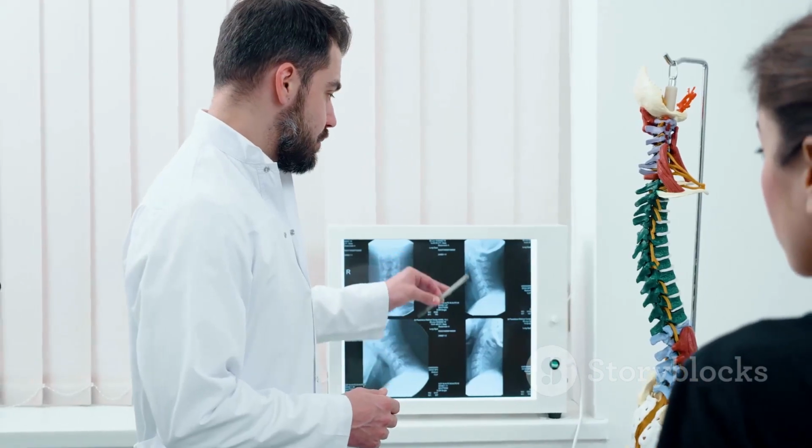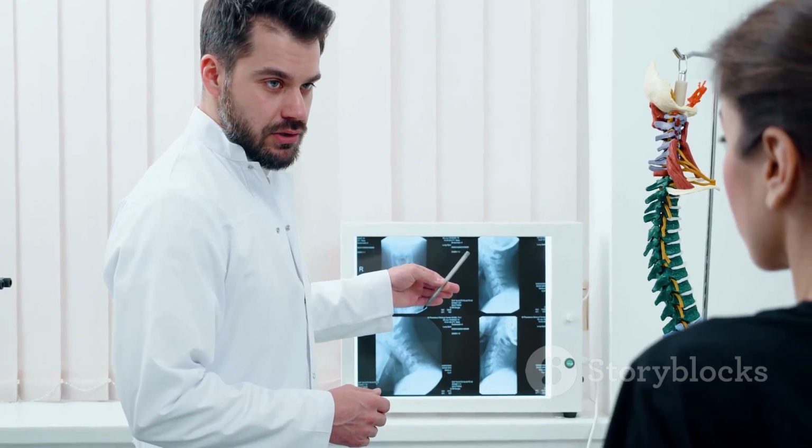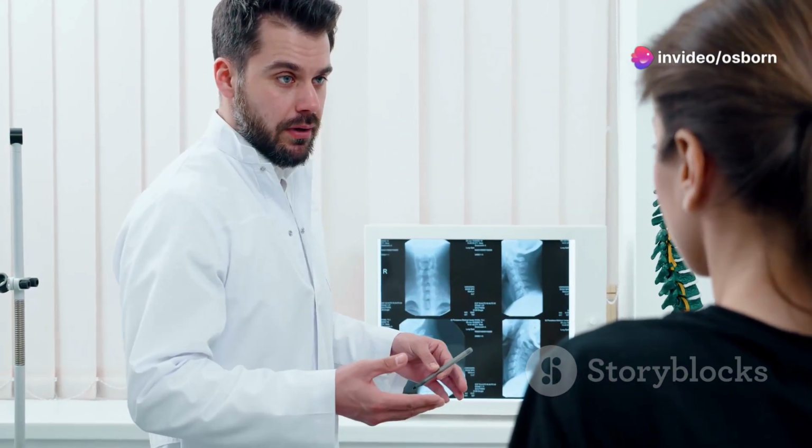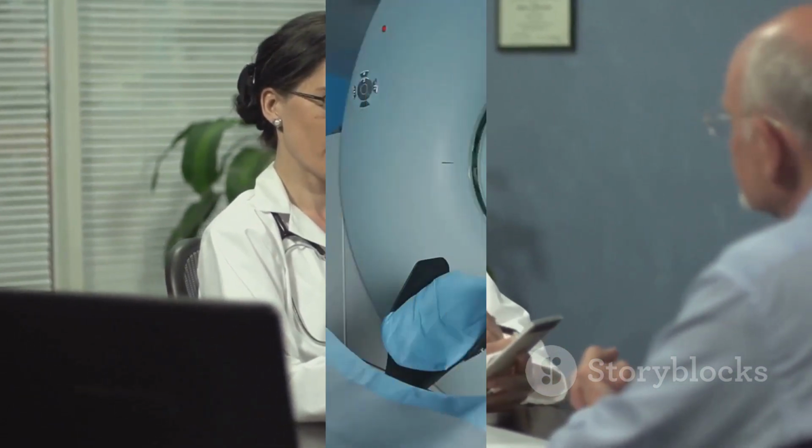Understanding PDD is crucial for treatment planning, allowing clinicians to predict and control the distribution of radiation dose within the patient's body. This ensures that the tumor receives a sufficient dose to effectively kill cancer cells while minimizing the impact on surrounding healthy tissues.